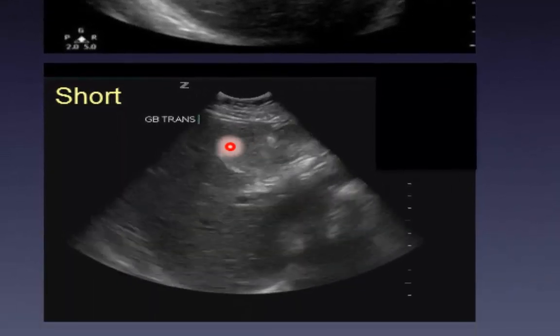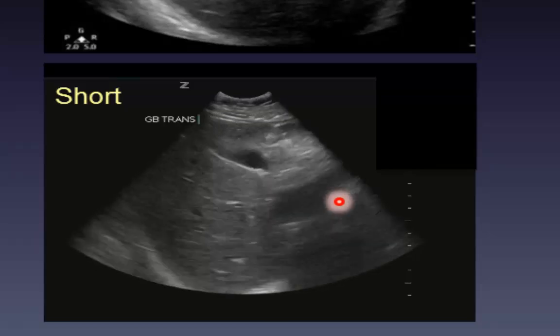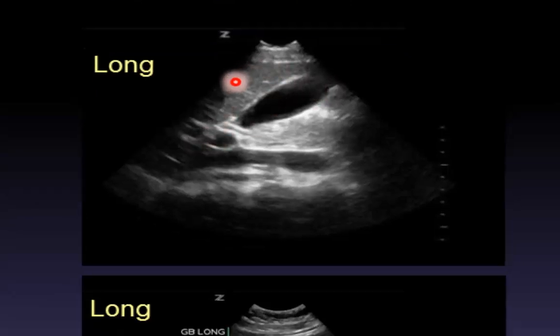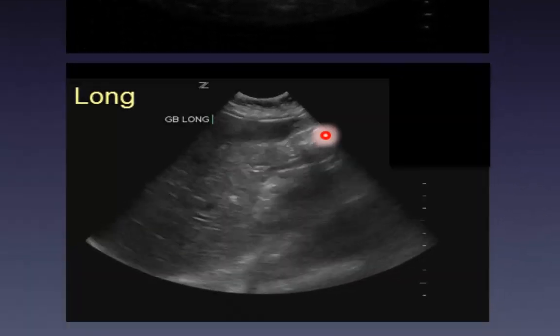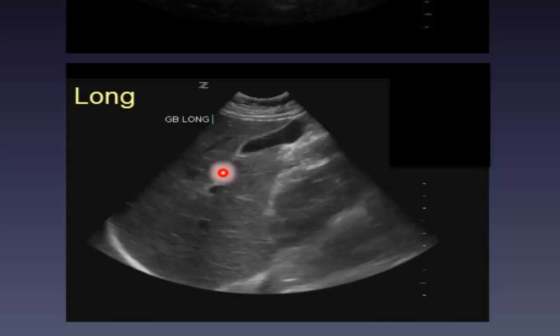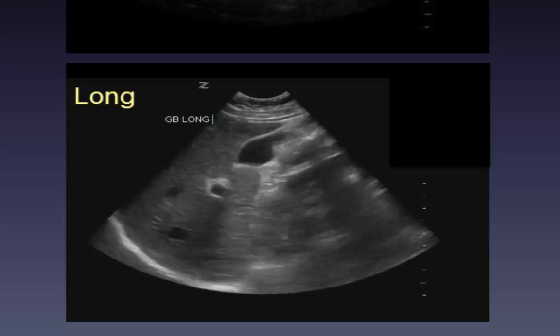This is similar, just shown in a clip form. Gallbladder, portal vein pops into view. And here in some long axis views, we see the long gallbladder and the portal vein right next to the liver. And in this clip, again, we see a long axis view of the gallbladder. We can see the main lobar fissure pop in and the portal vein right down here, making the point of our exclamation point.